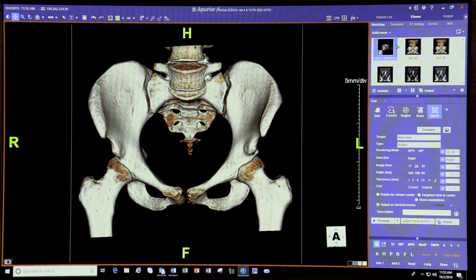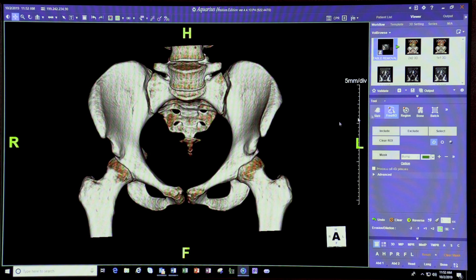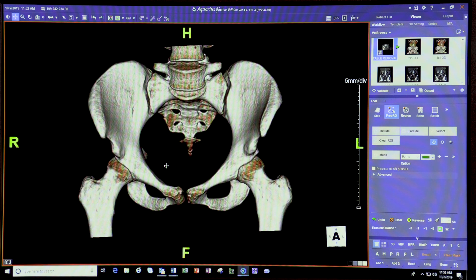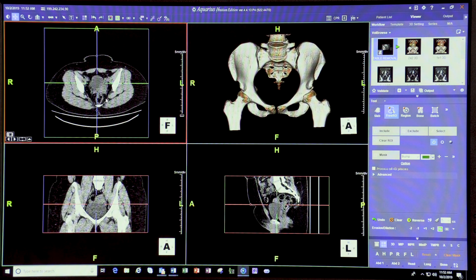To segment these bones, there are multiple ways of doing it. In Terra Recon, you can use the free region of interest and select individual bones, or you can do a region grow and select an individual bone and then patch them into a movie. Let's start with the free region of interest, which is the more complicated way. This method works when the bones are very close to each other — for example, in an older patient with osteoarthrosis.